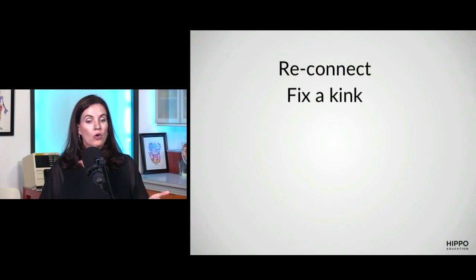You could say, oh, look, the tubing is kinked in the bed rail. Somebody put the bed rail down. I'm going to lift that up and fix the kink. I'd say check that before you call your RT, because you don't want to be the guy where RT shows up like, oh, well, you just had to do that.